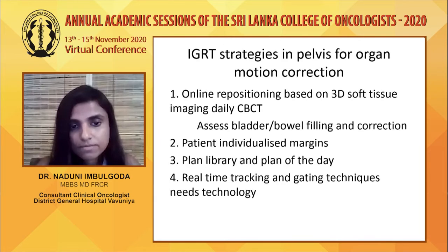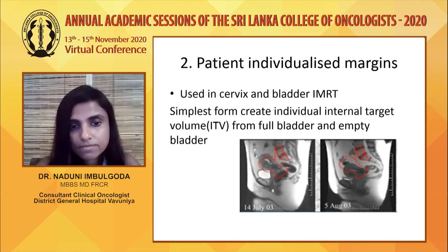And other IGRT strategies for pelvic organ motion correction. The first one we discussed, which is online repositioning. So we'll move to the next one, which is patient individualized margins. This is used especially in cervix and bladder IMRT. In its simplest form, we create individualized internal target volumes between full bladder and empty bladder. So here the bladder is full, here the bladder is empty.